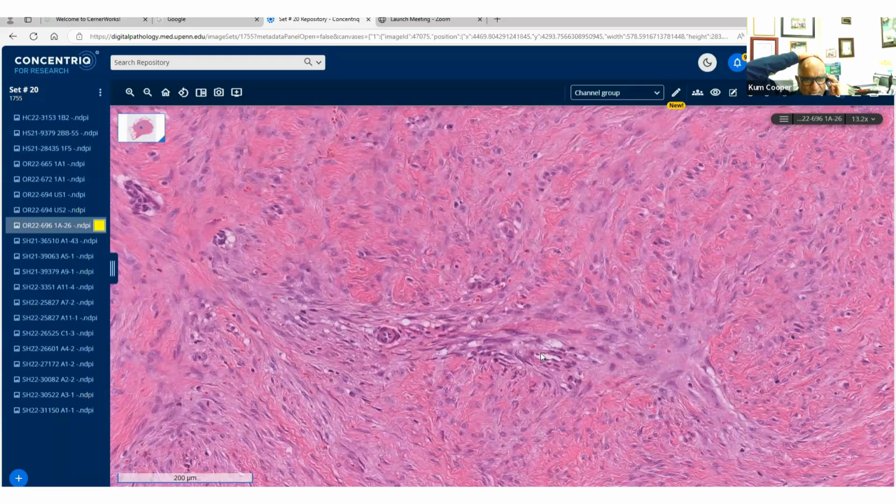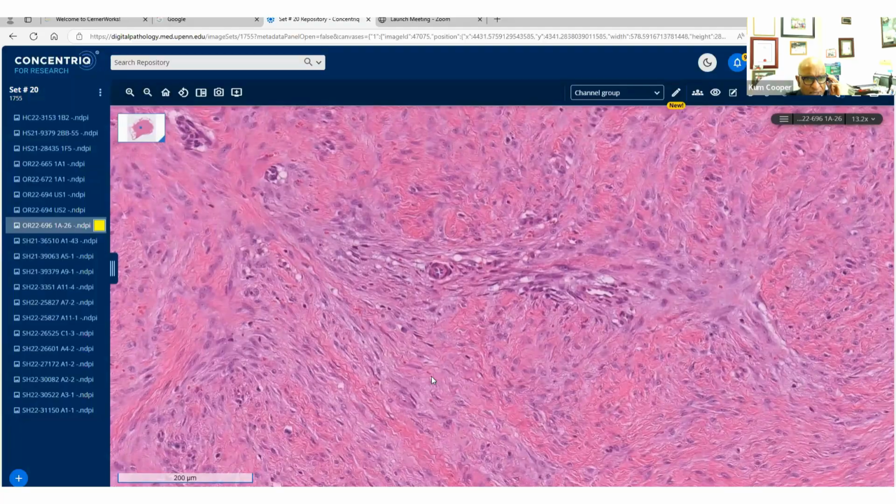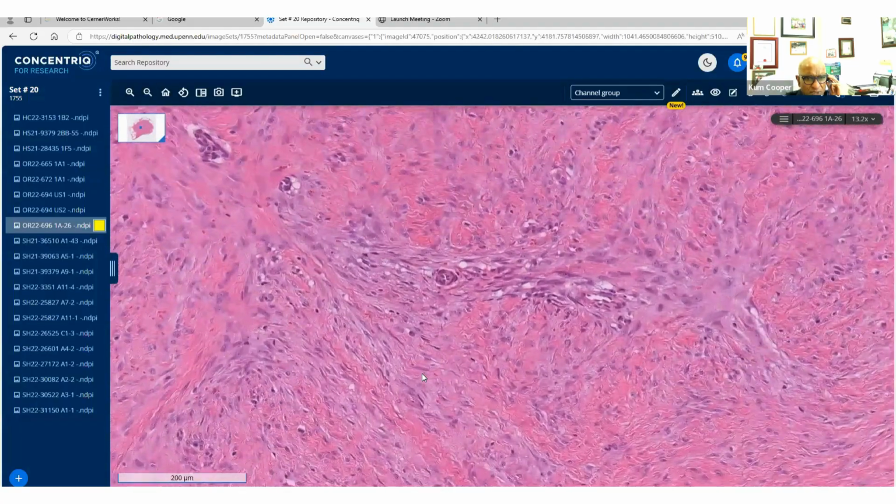And the key, you may get some actin. Typically desmin is negative, but you could get some focal desmin as well. And those two would help. And beta-catenin, of course, is the nail on the head, because you're looking for nuclear beta-catenin, which is very focal and very patchy. Now, the reason I put this in is because we often get needle core biopsies from these.